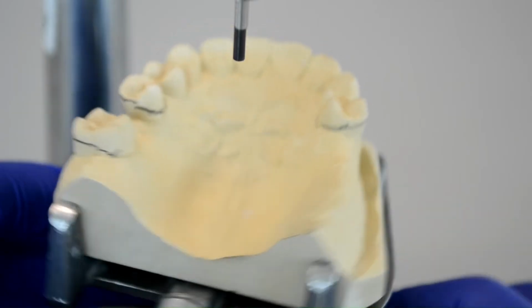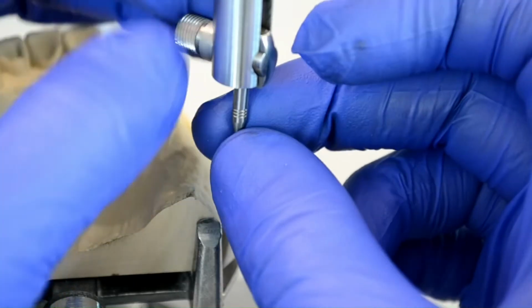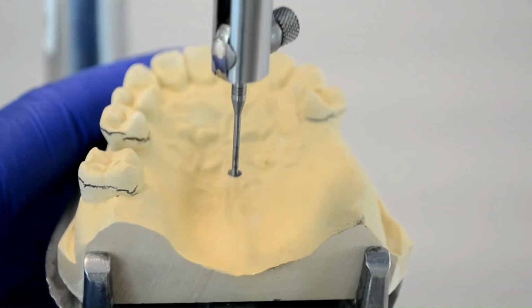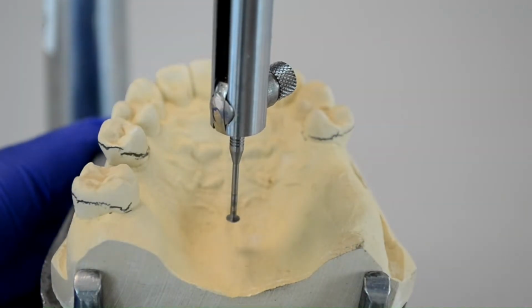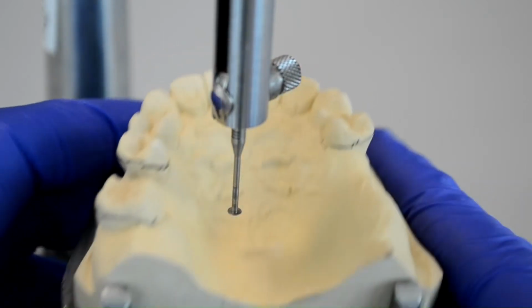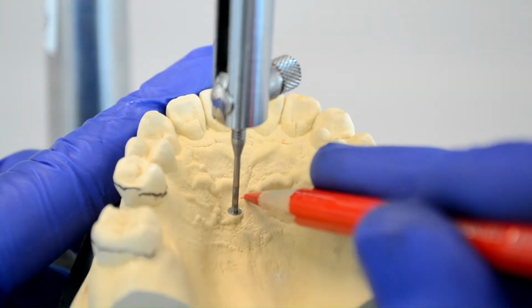With this, the surveying is completed, but in order to save the position of the cast, we need to tripod it. This is done using a .03 undercut gauge. The .03 undercut gauge is attached to the mandrel, and the mandrel is lowered so that it would allow that undercut gauge to touch the cast at 3 different areas without having to move the mandrel up and down.